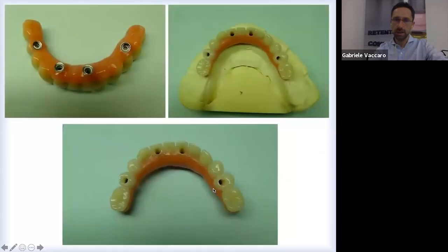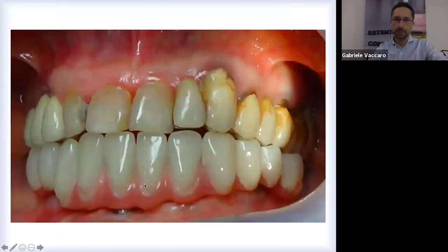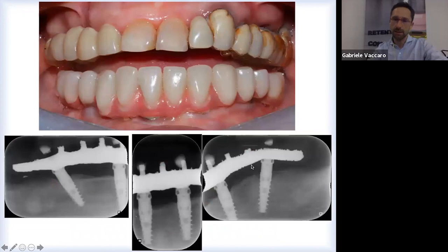I don't spend a lot of time. This is the definitive framework. So we remove the temporary bridge after 6 months and then apply the definitive framework.